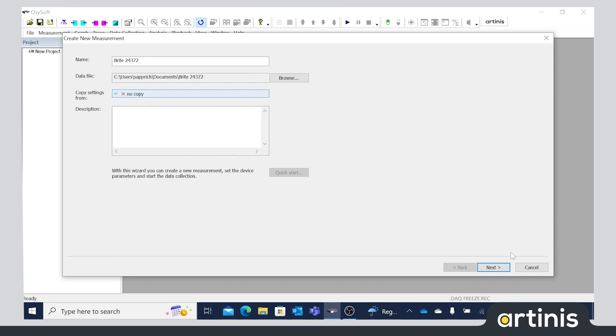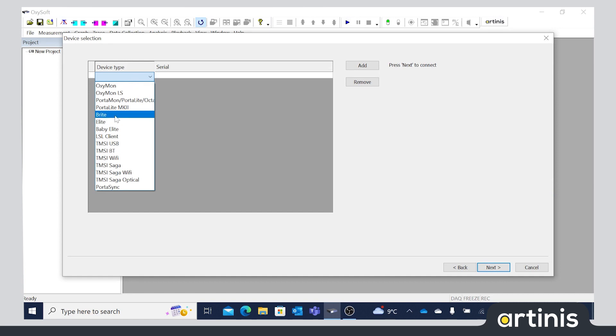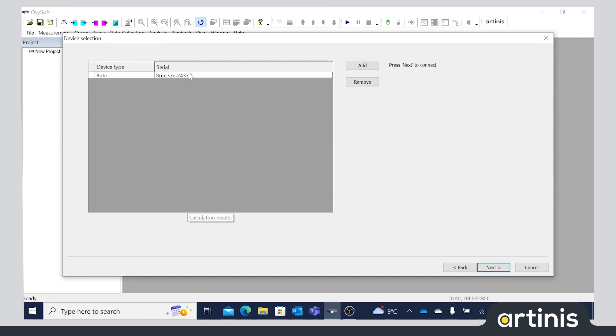Next, it is possible to start a measurement in OxySoft. The device and its corresponding system ID should now be displayed in the device selection and connect to OxySoft.